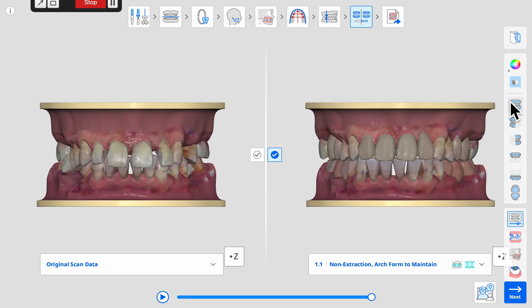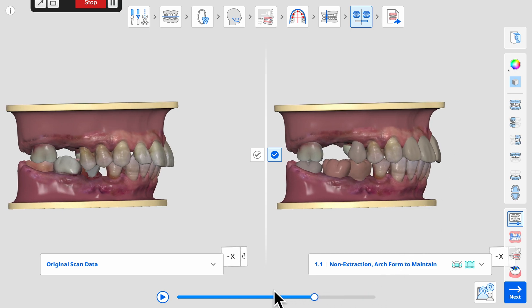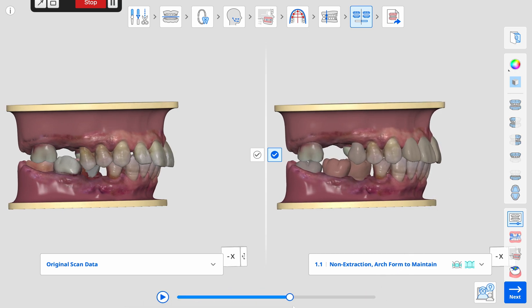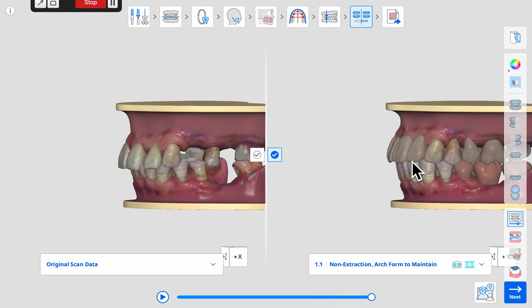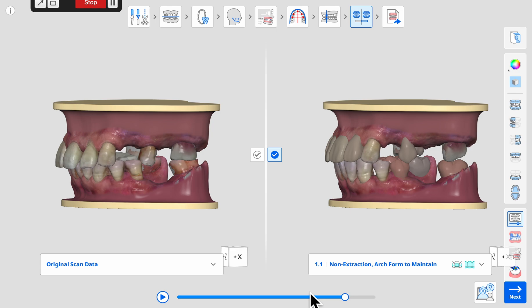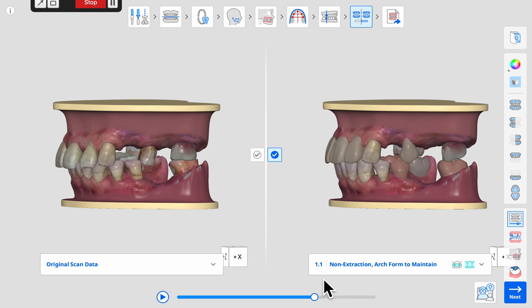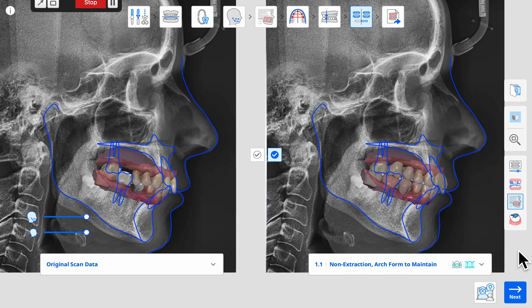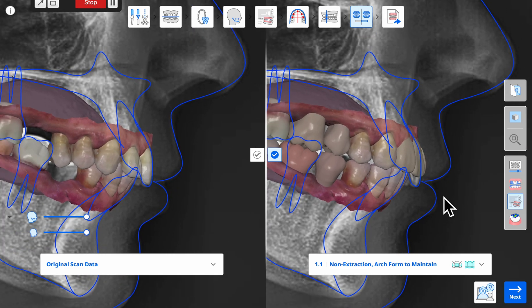In many of our restorative cases there are teeth or quadrants that have over-erupted due to missing teeth. The simulation helps visualize the need for skeletal anchorage or TADs during orthodontic treatment to idealize the alignment for the best prosthetic restorative outcome.